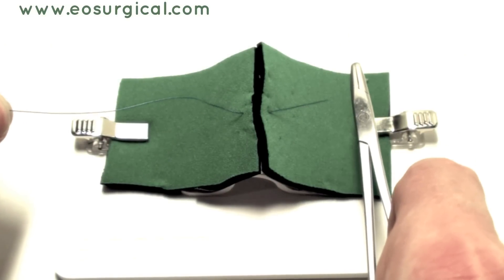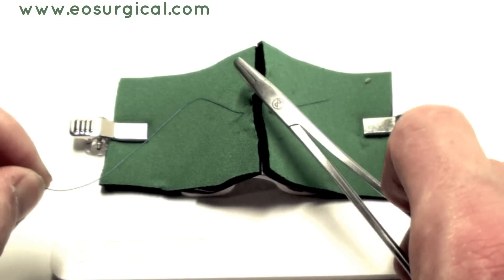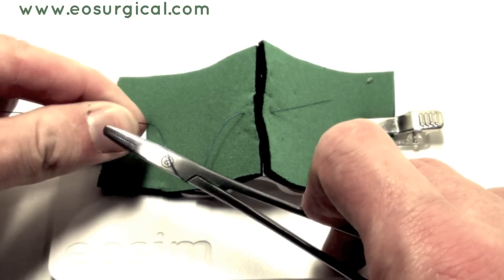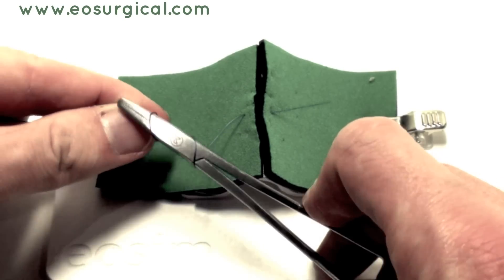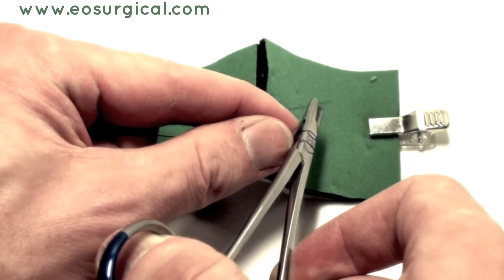Pull your suture through. There's only a small amount of tail left at the end before performing the instrument tie. To do this, you need to bring your instrument from the short end towards the long end, then wrap it around twice.